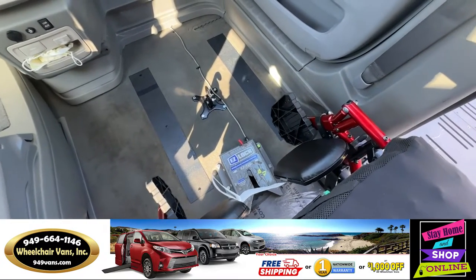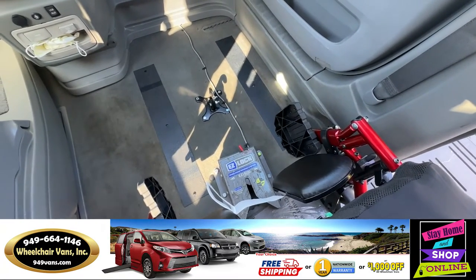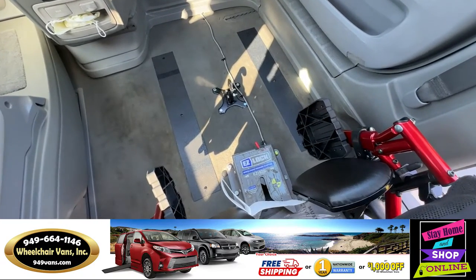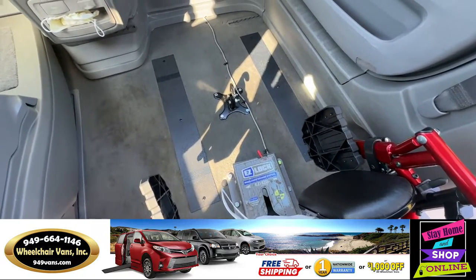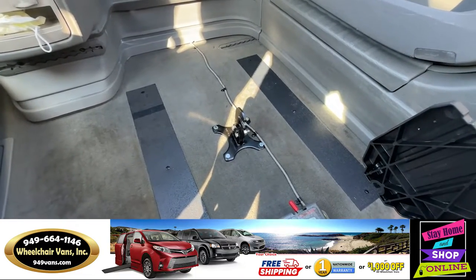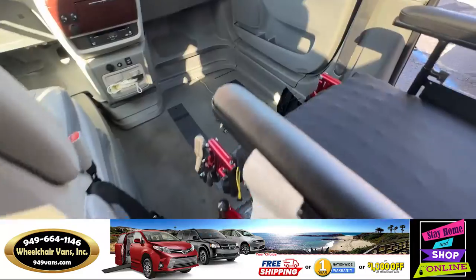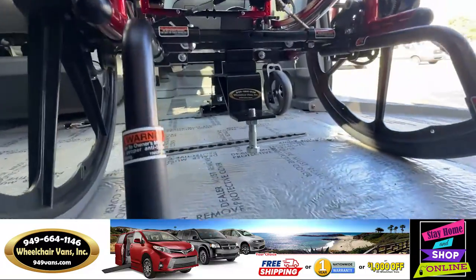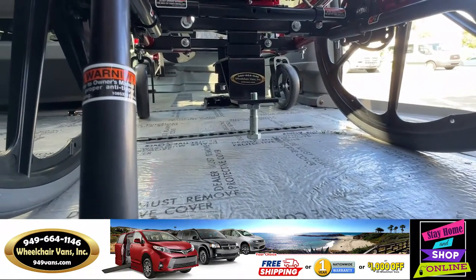Hello, today I'll be going over a tutorial on how to use the EZ-Lock system. The first thing you'll notice is you have the EZ-Lock system and a lock mechanism, and then on the bottom of the chair you will have a pin that sticks right at the bottom of the chair.